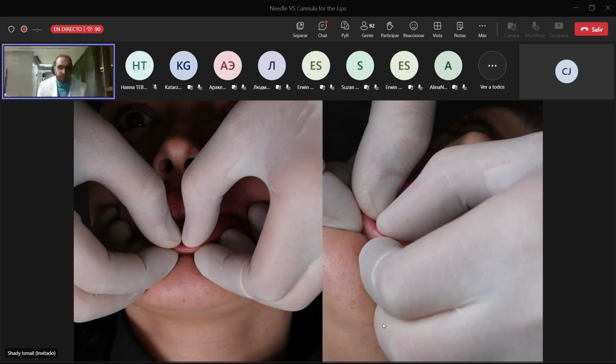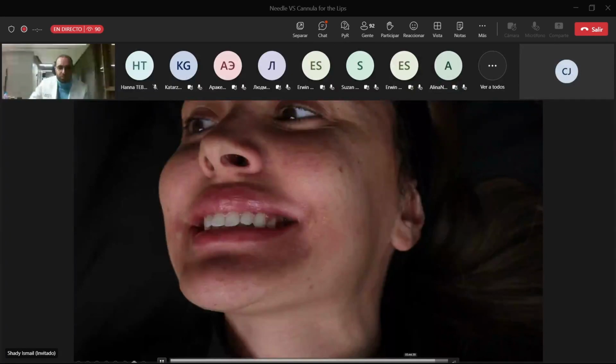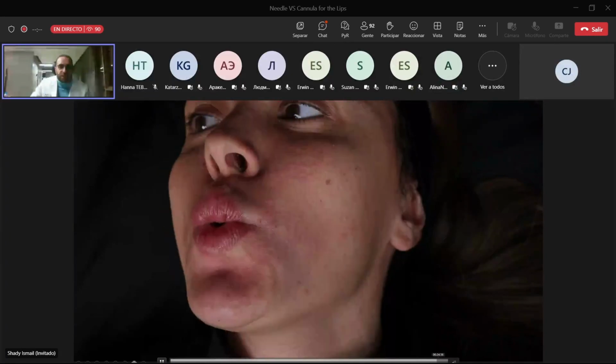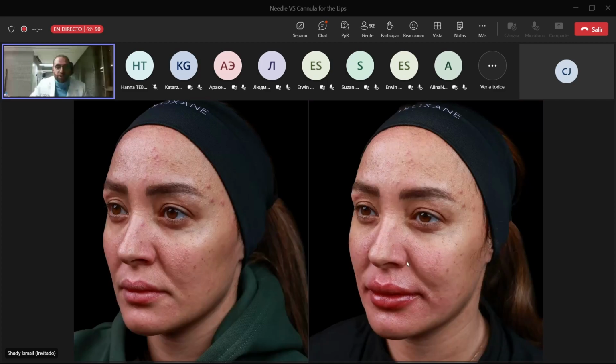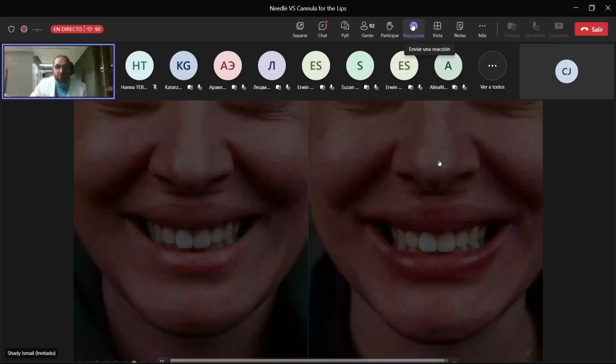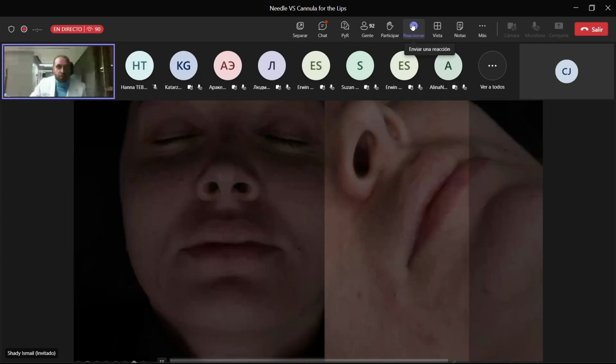Here we removed it. And then we can see the before and after pictures, and during expressions, I have to assess my patient after injection: smiling, kissing. Now this is before and after pictures, half view, you can see the definition. Also, these points can define the facial corner without injecting them, during smiling, symmetrical, and during kissing, obviously.